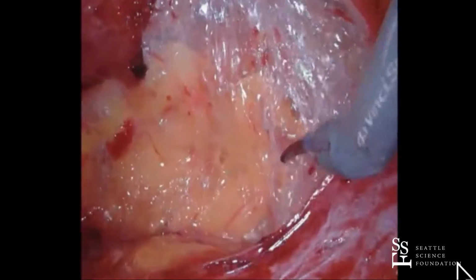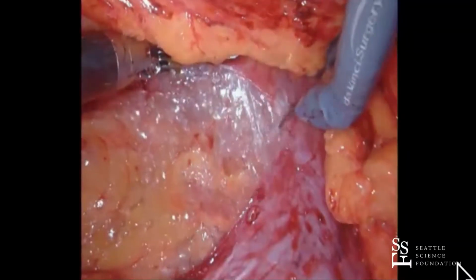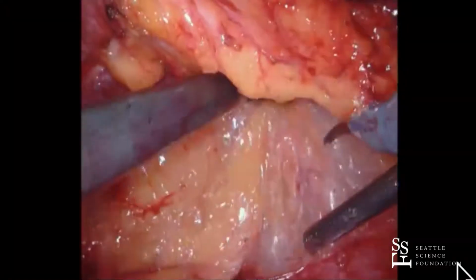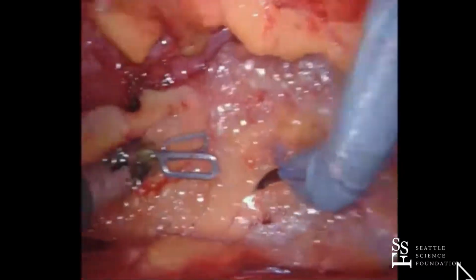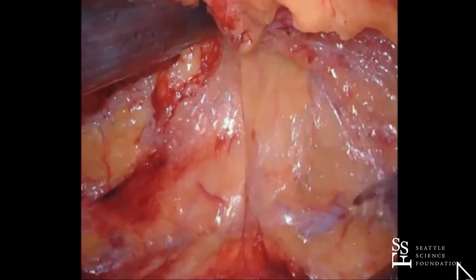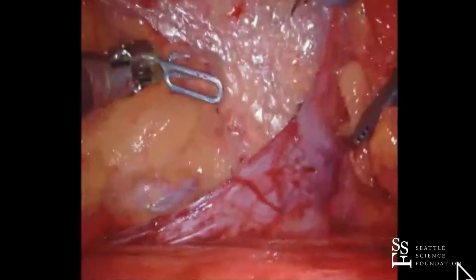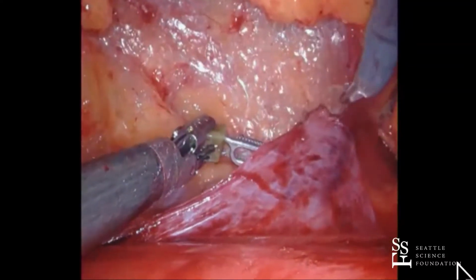And as you go this direction, the peritoneum is going to come up here. We can take it to right about here probably, and then we just kind of have to say hello. So now what we do, and you can see kidney right there, we basically walk along the psoas muscle and then we start to see some landmarks, okay? There's an artery, there's cava. I'll show it to you better here in a second. But I know on the right side, the cava is going to be right there.